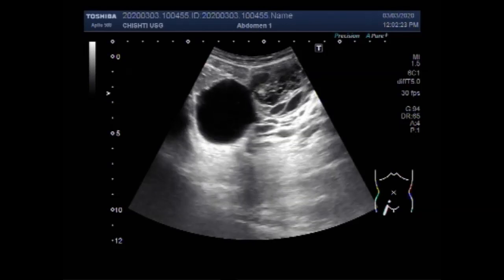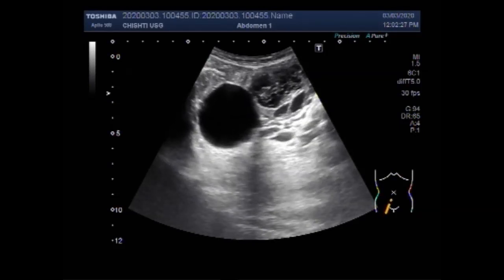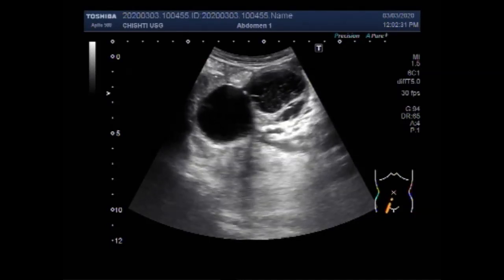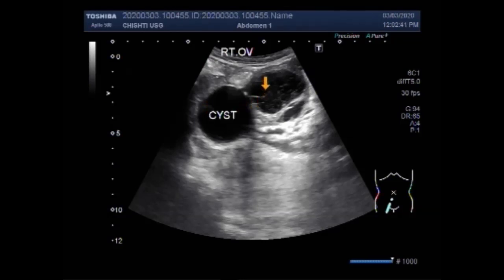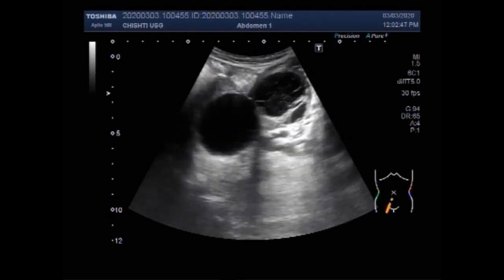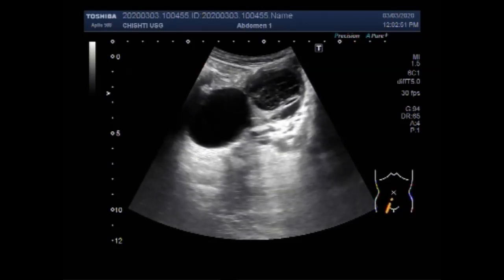The larger cyst is a simple ovarian cyst — that is a follicular cyst. There are two types of functional ovarian cysts: follicular cysts and corpus luteum cysts. A follicular cyst contains a follicle that has failed to rupture and has filled with more fluid. A corpus luteal cyst occurs when the follicle ruptures to release the egg but then seals up and swells with fluid.